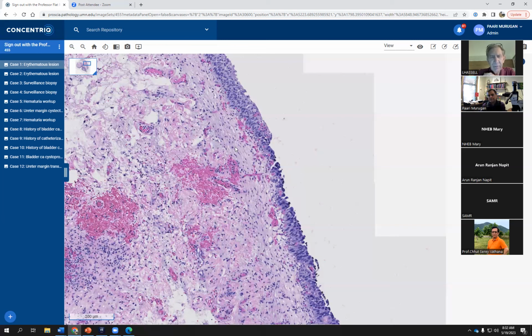And as far as P16 is concerned, I really haven't used it in the setting of diagnosing carcinoma in situ in the bladder. I think because the P16 is often expressed coincidental with the P53 mutation, in that particular setting where you're wondering, is this null, is this wild type, it can be a valuable internal control, if you will. At least I use it that way in the endometrium or the ovary at times. Yeah. Okay. Thank you. That's a good point.